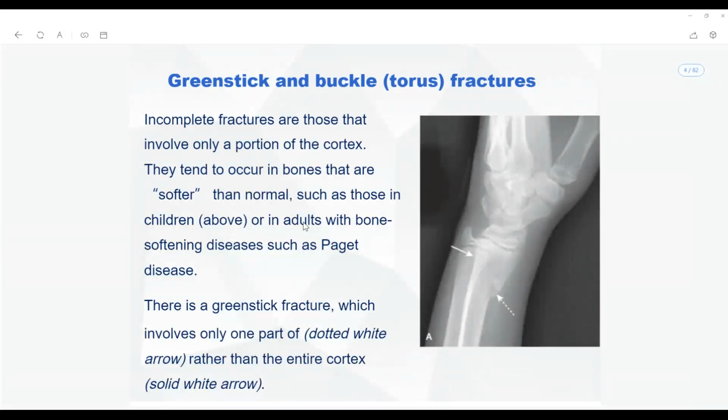So when you are writing a prescription, you are going to say that I am going to look at both of your hands. Write in the prescription x-ray hands, not only right hand, unless you know what you are looking for. Okay, so always compare your x-ray with symmetry. First rule. Okay, rule number 1, please take a list of all these rules. It will be very helpful for your clinical practice. Yes, are you guys following me?